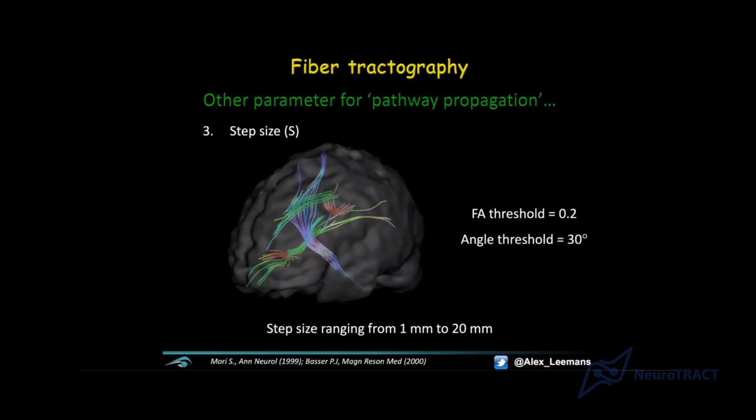When you're doing tractography, and this is the cool thing, we're continuously looking through the data. Where is the dominant orientation of my diffusion profile? But if you're at a location where there is no voxel, and technically speaking that is everywhere, because you're continuously taking a little step, you enter a region and, hey, this is not in a voxel. It's in an area surrounded by voxels, where you get a weighted average of the neighbors. That information will be used at that exact continuous location.